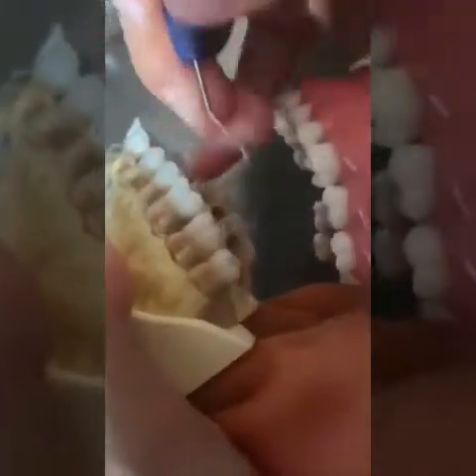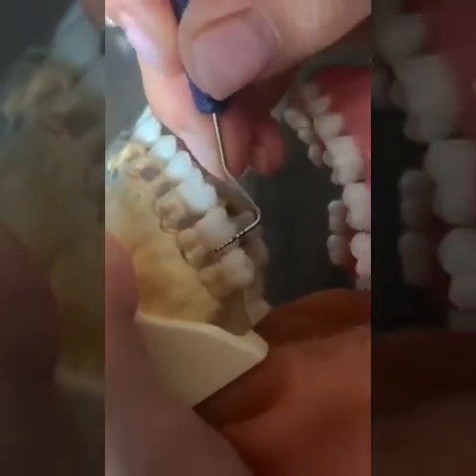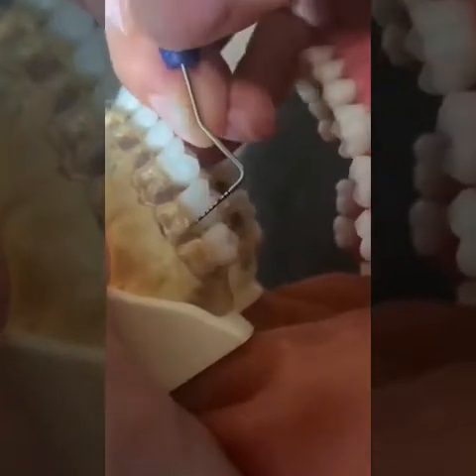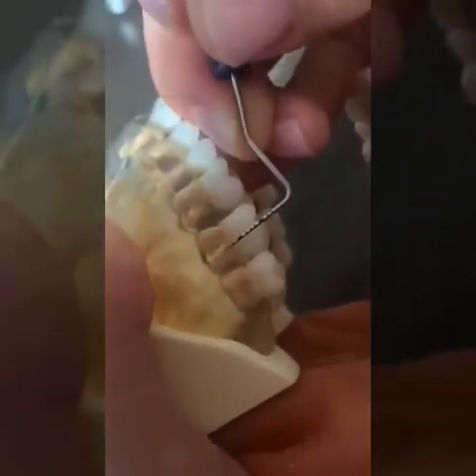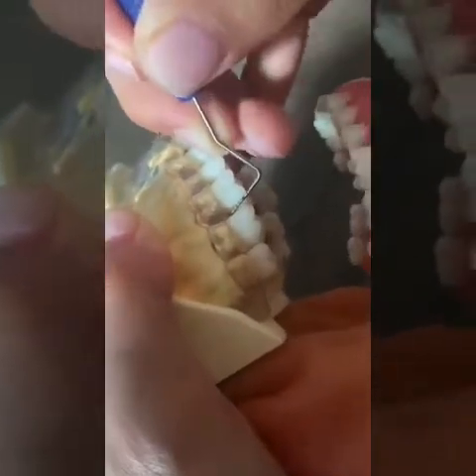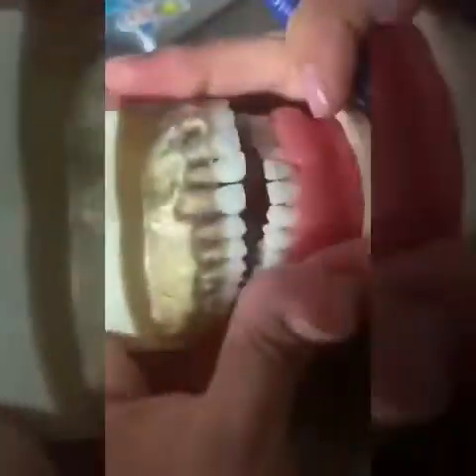We're going to go to tooth number 2. We're going to insert at the distal line angle, walk into the col space, interproximal area. We're going to tilt 10 degrees and record. Remove instrument, put it in the distal line angle, walk to the mesial line angle, record, and then keep walking into the interproximal area, tilt the instrument 10 degrees and record. We're going to do this all around.